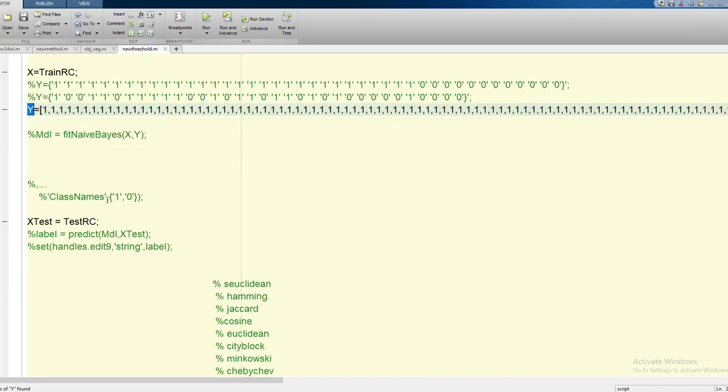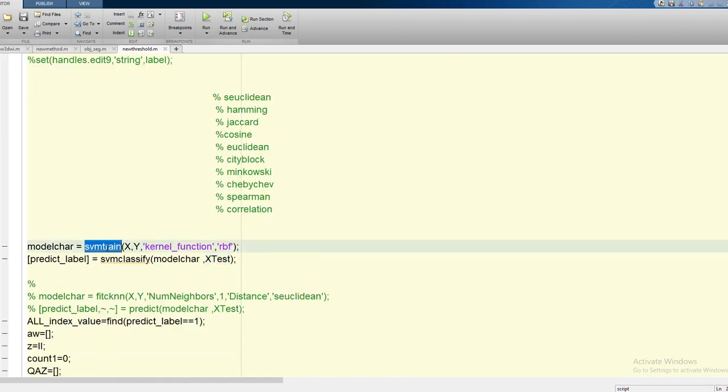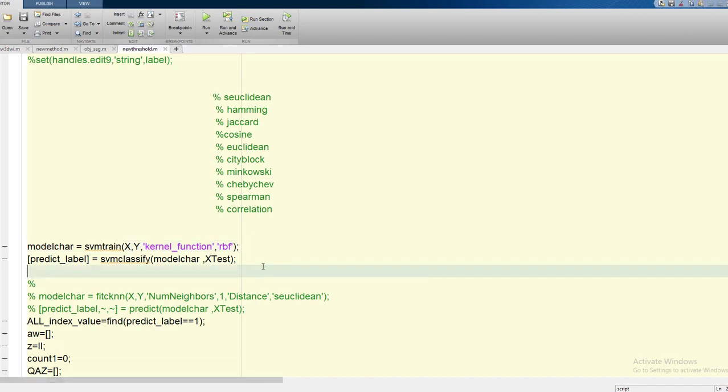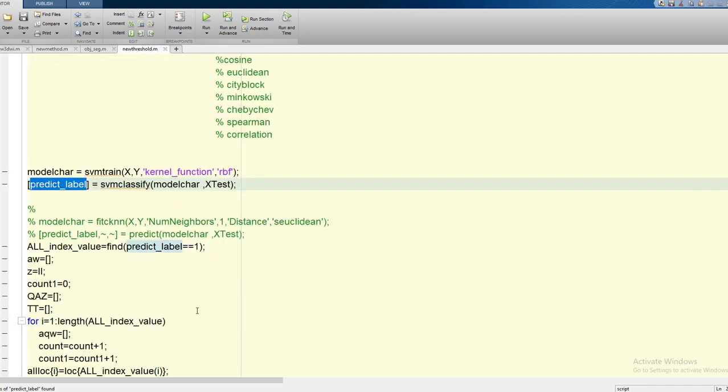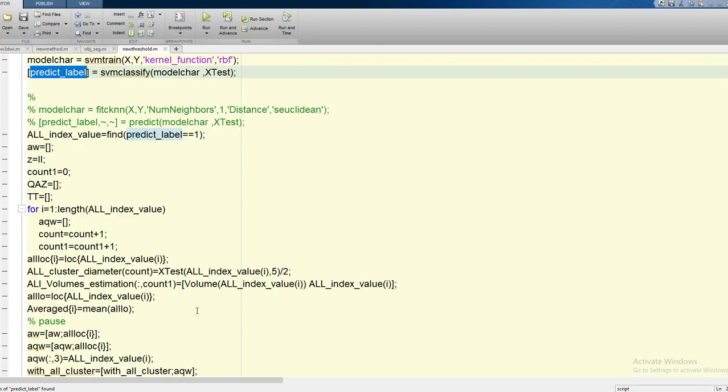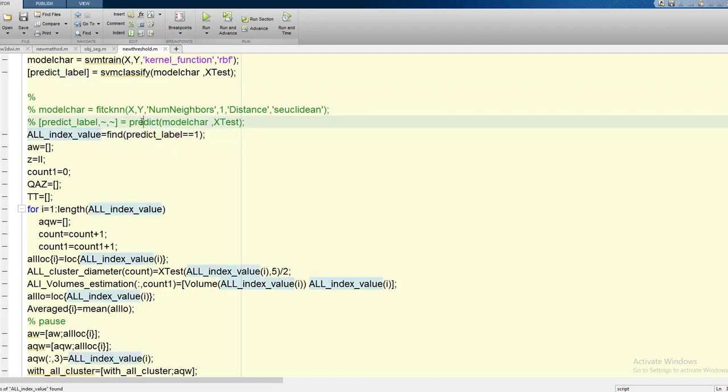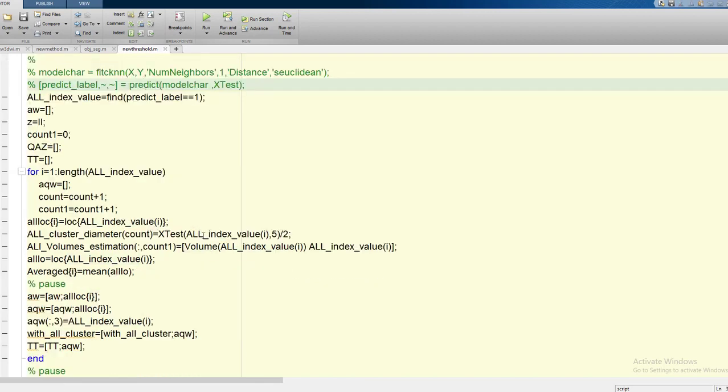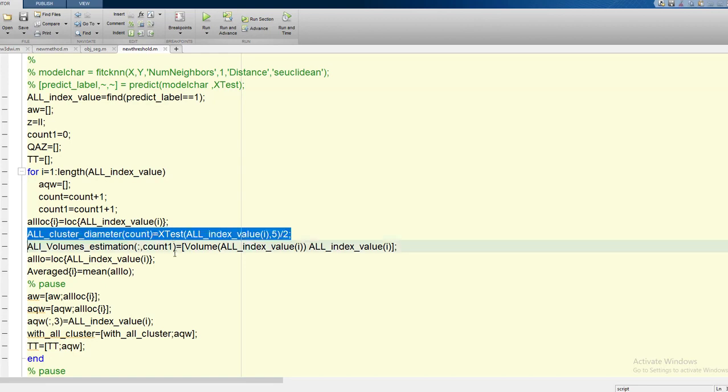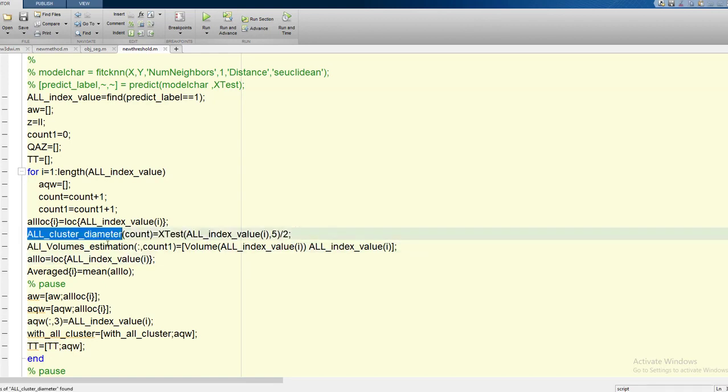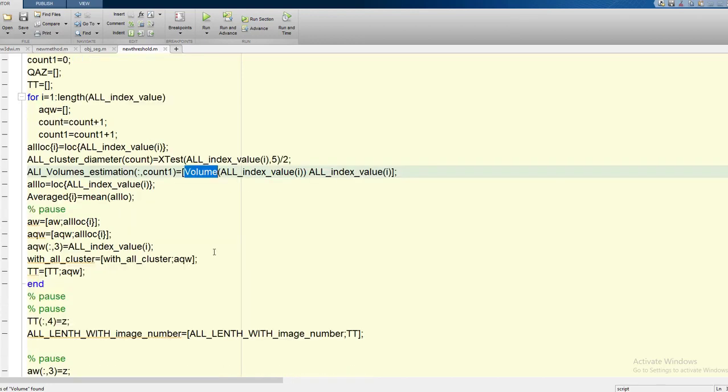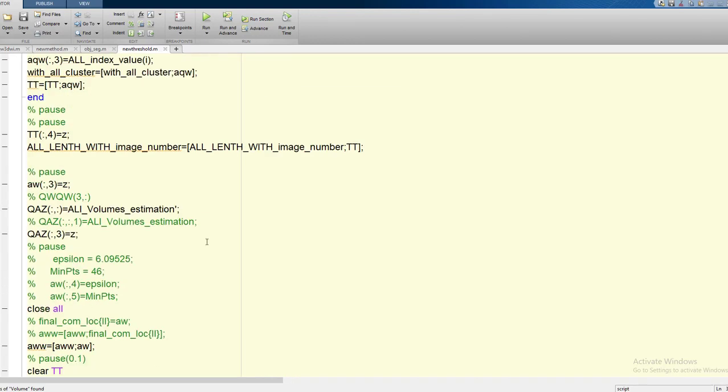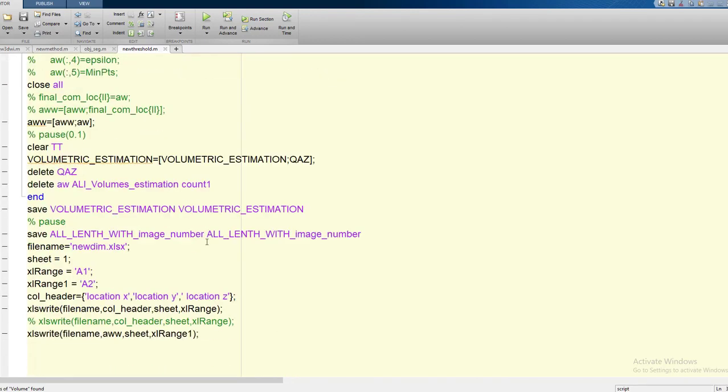After fetching those pre-trained isolated measured nodules, I put them into some variable and I apply support vector machine. Because I have small data, support vector machine always performs best. If you haven't learned about support vector machine till now, just go to my previous videos. I have made plenty of videos on support vector machine. Here I train it using RBF kernel and classify it. I will be getting predicted nodules and the cross pointing to that nodule. The outcome I extracted and measured the diameter of those nodules, thereafter do the volumetric measurement.